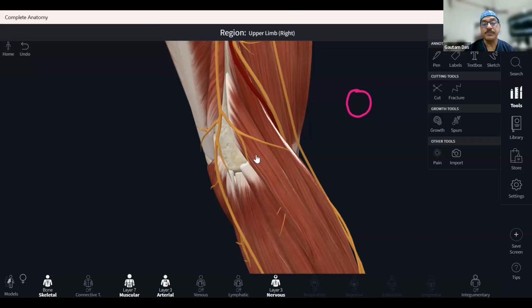that is the one tendon. So one tendon, 4 tendons are there. Medial side, there are 5 tendons. The lateral side, there are 4 tendons. So the most superficial is your extensor carpi radialis brevis. And remember, in the second compartment another muscle is there, that is extensor carpi radialis longus. So that does not take part in the common extensor tendons.